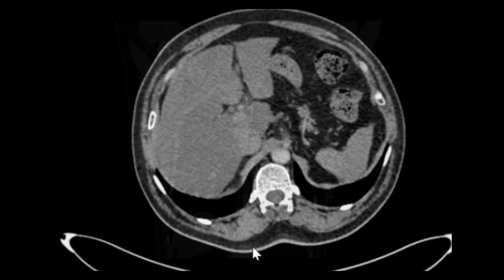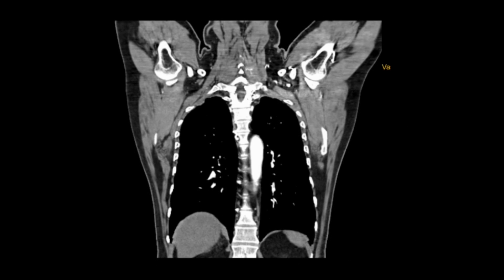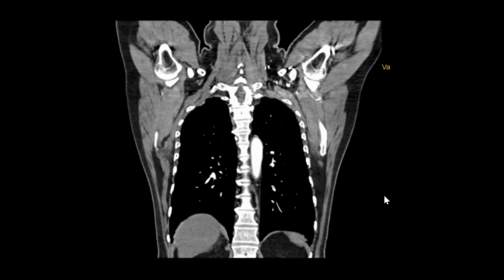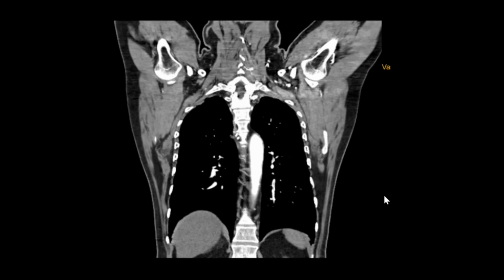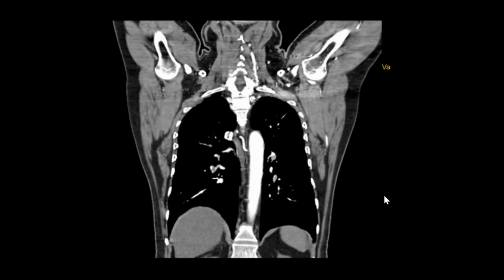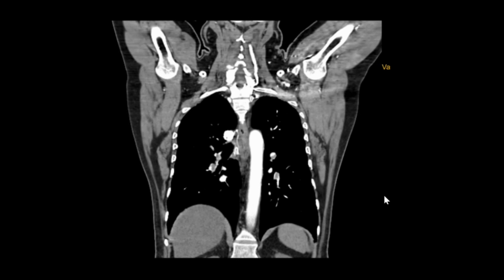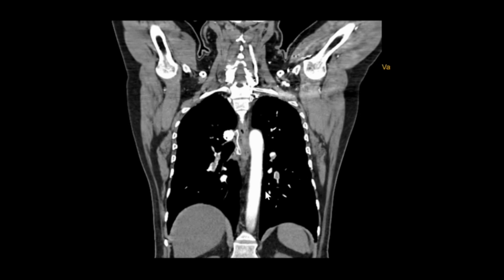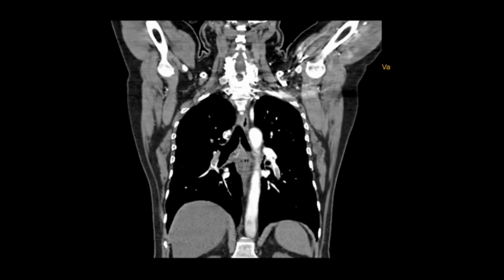Next we'll see the coronal MIP images — that is, maximum intensity projection images. Moving from posterior to anterior, we can see the descending aorta and pulmonary artery branches filled with thrombi, as we saw in the axial images.